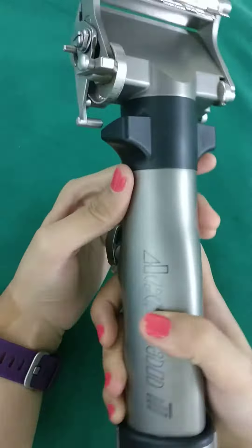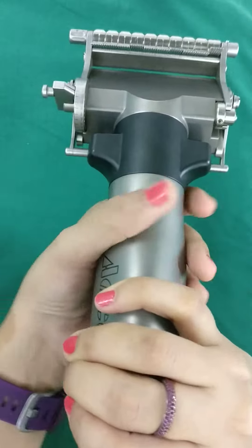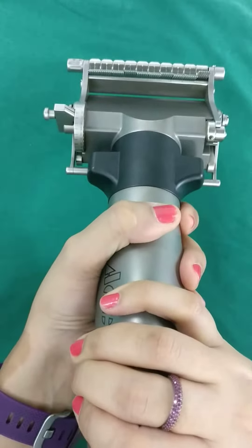When holding the dermatome, the button will be on the lower side and you hold it from the top. If you are right-handed, it is easy to get a good grip on top and support it from below with the left hand.